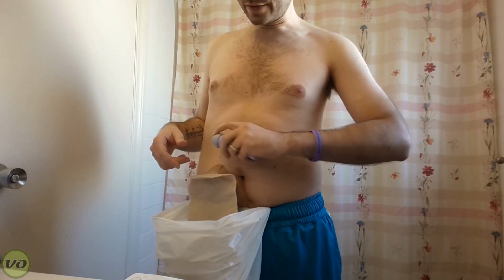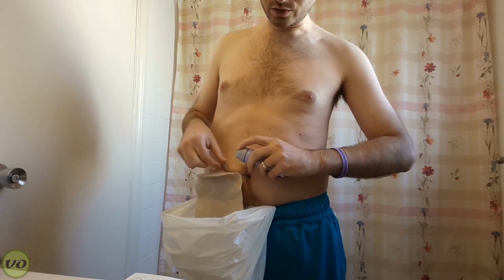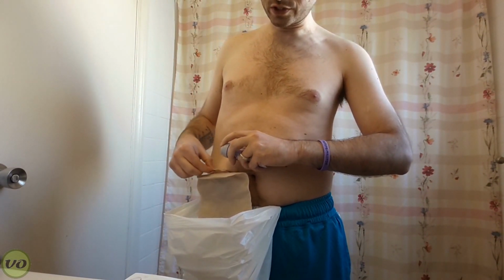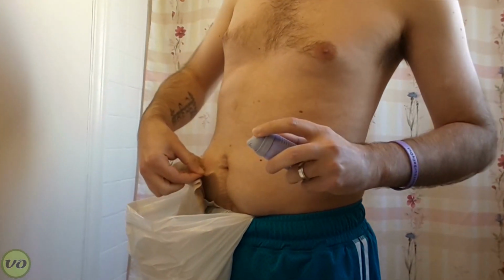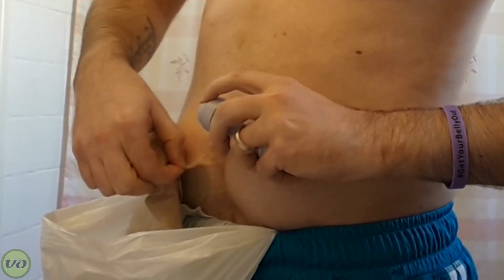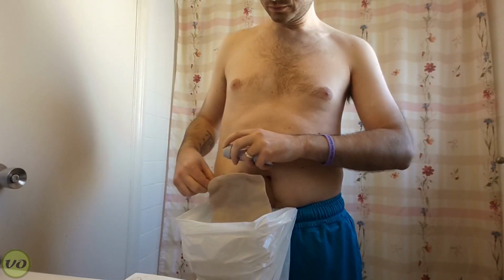But I know with Hollister, I always tend to have some residue left over, which you'll probably see here. So you want to spray this just along the edge, and what that'll do is it'll start to soften up the adhesive. And I just generally keep spraying as I go. And on this particular product, as soon as you reach that center part of the wafer, things will just come off very easily. But I'm not sure if you can see on the camera or not, there's a lot of stickiness still left on there, and that's what I'll use the wipes to get rid of.